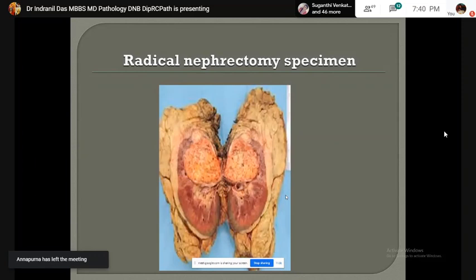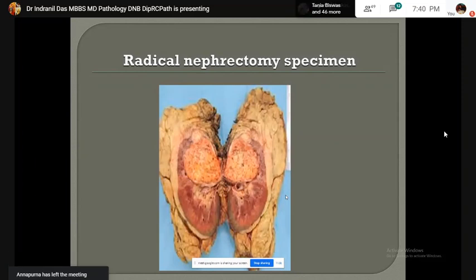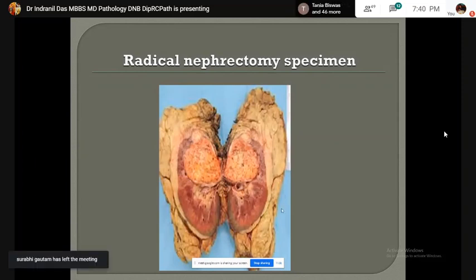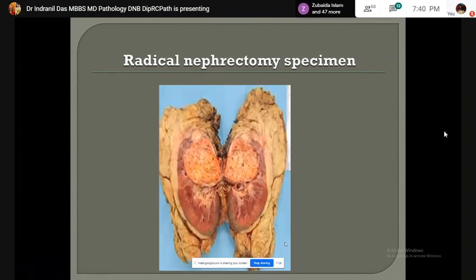After receiving the specimen, the outer surface of the kidney should be inked. If incision is made prior to inking, retraction of the renal capsule may occur, which may give a false positive impression of perinephric fat invasion. A midline longitudinal incision is preferred, given from lateral border of the specimen to the medial border. Alternatively, a probe can be inserted into the collecting system and the specimen can be opened via this channel.